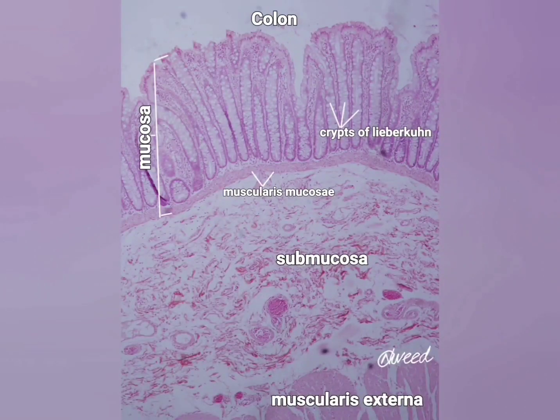This is light microscopy of the colon. The wall of the colon consists of four layers: mucosa, submucosa, muscularis externa, and serosa or adventitia.